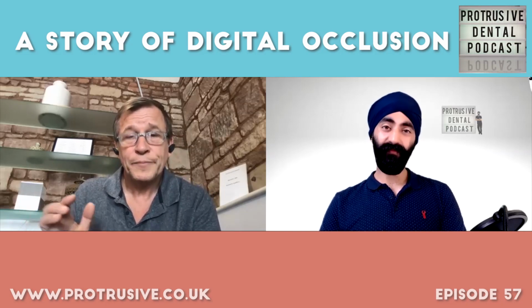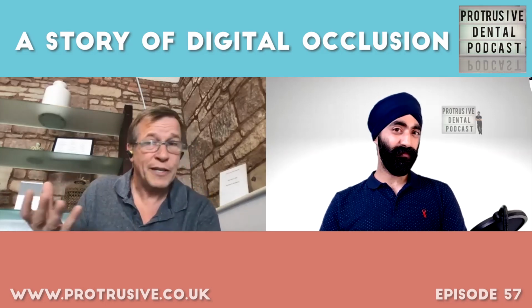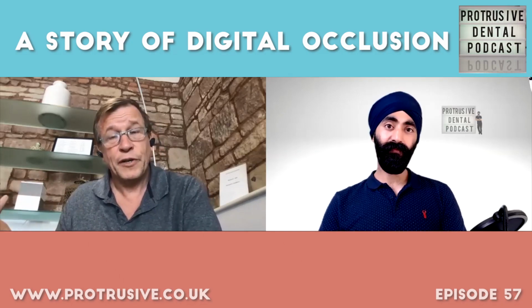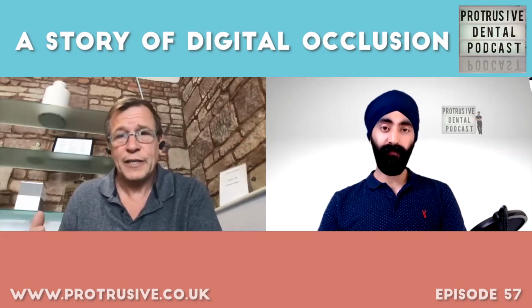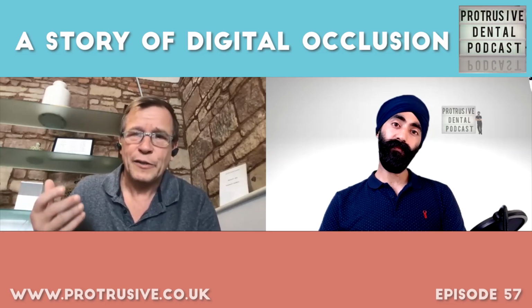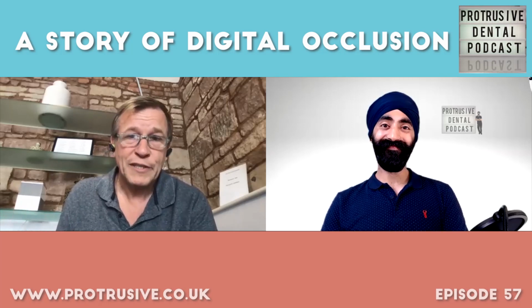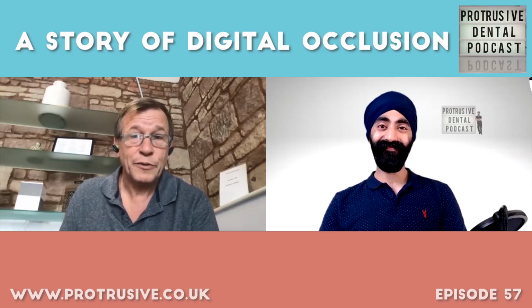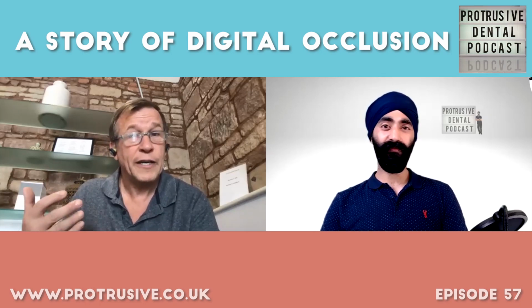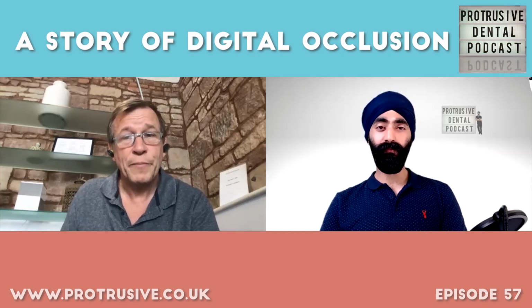When we talk about digital, we could talk about ways that we can use it in examination, and we certainly use it for intraoral scans, for getting models. I think that's a routine thing these days. We take photographs. Photographs are a great record of what we've done today. They're a great communication tool so that patients can see what we can see, and they also help us in our two-dimensional planning. So photographs are still a really important thing.